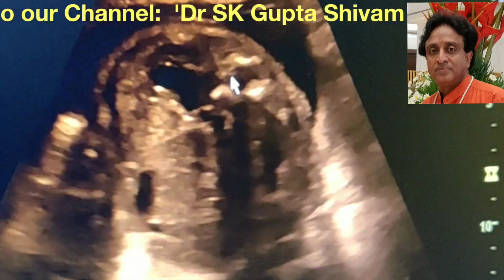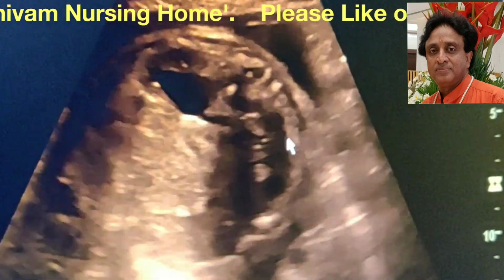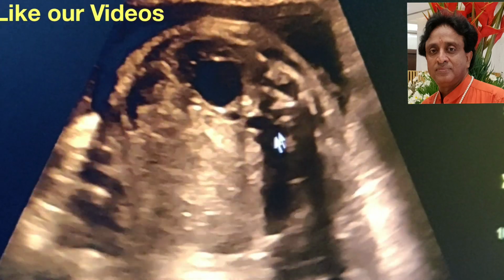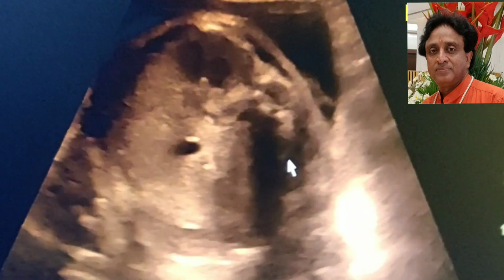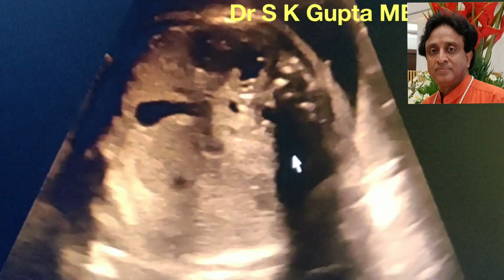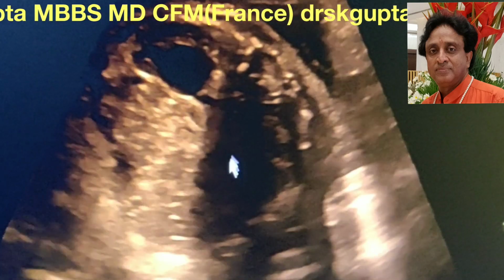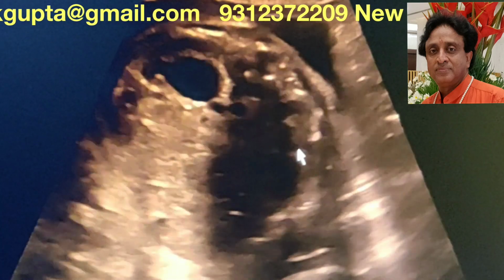The other kidney, if I try to look at the other kidney, this is the other kidney. The other kidney does not seem to be that dilated. It does not seem to have any dilatation on the left hand side. The right kidney is markedly dilated. You see the other kidney now is partly occupied by the shadow of the spine because of the position.